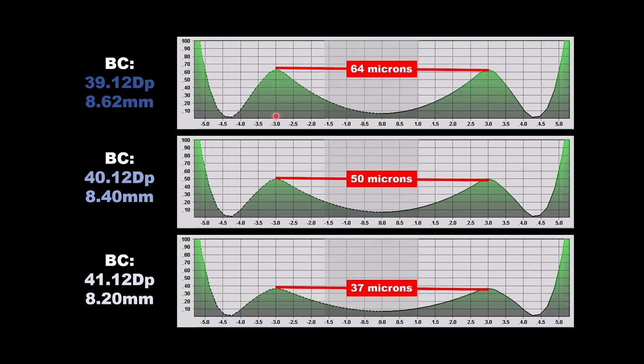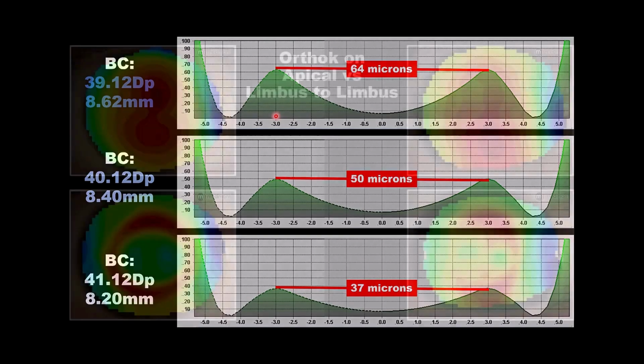Since the patient isn't getting to +0.50 sphere, we're at plano, we could probably push a little bit more hydraulic force here, and hopefully by taking the patient to +0.50 along the flat meridian of the eye, we might get a little more hydraulic force across the steep meridian, maybe push out some of that cylinder. So increasing the effect is another alternative.